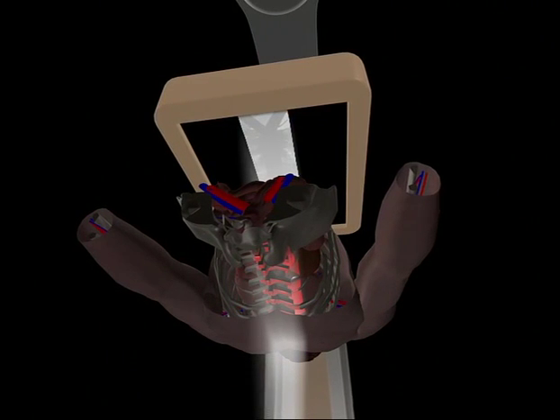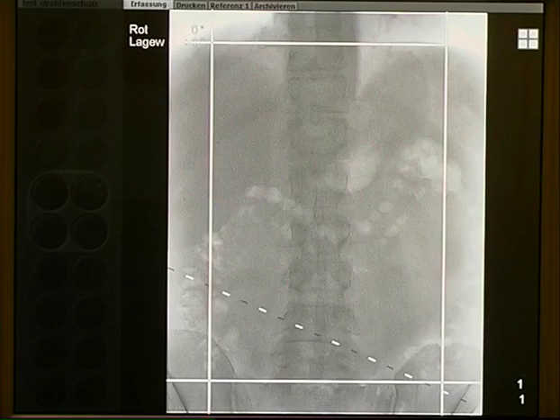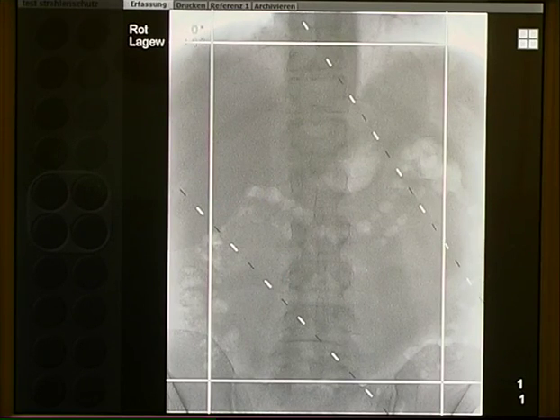Positioning has a major impact on image quality. The devices provided by the system, such as wedges and shutters, are to be used with positioning without radiation.